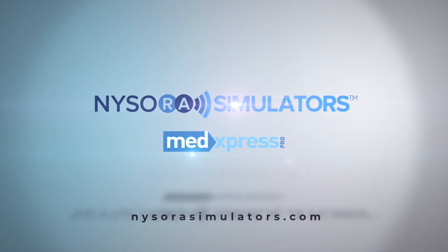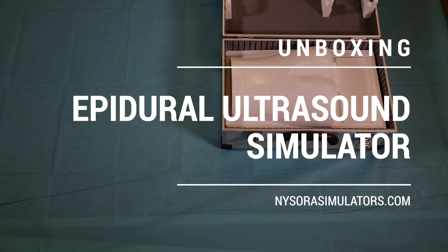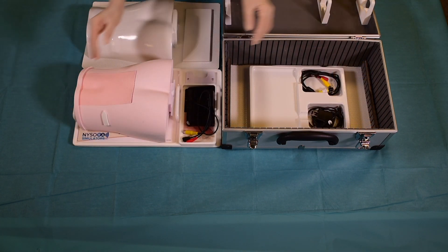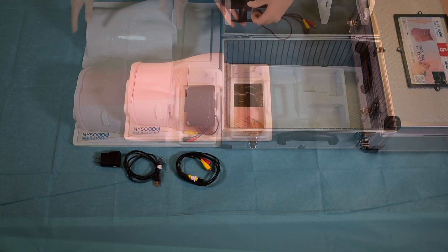Like all other Nysora simulators, the epidural analgesia simulator comes in a custom-designed box which is convenient for carrying and storage. To begin practicing, the simulator and all peripherals are taken outside of the box.